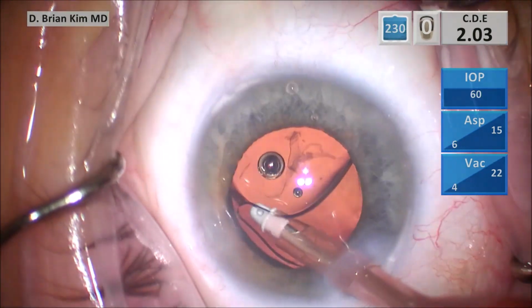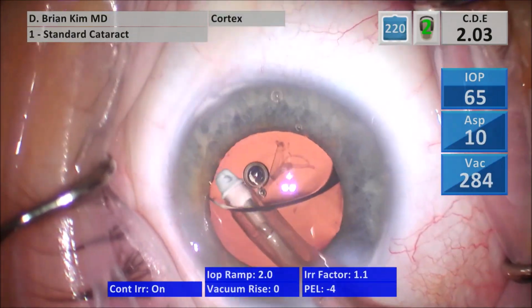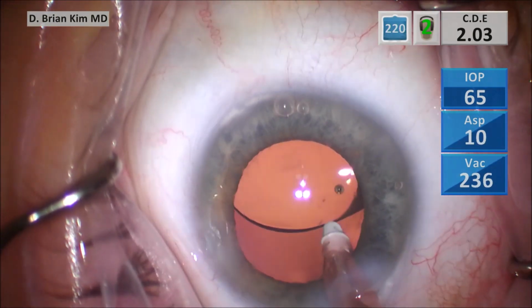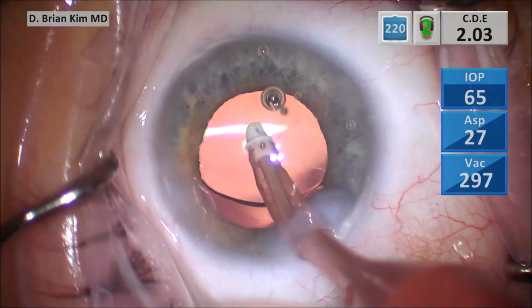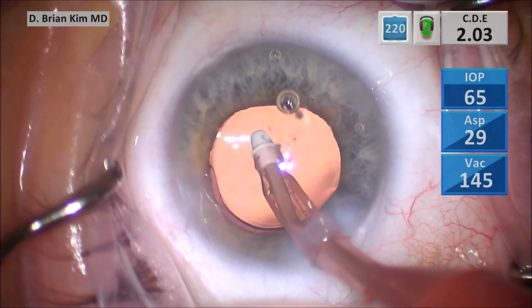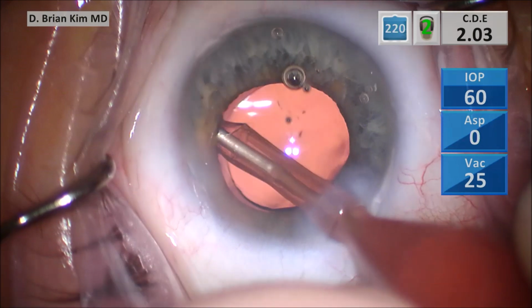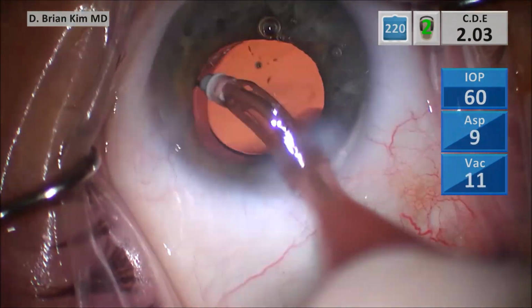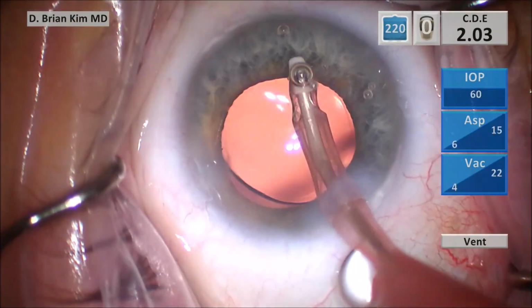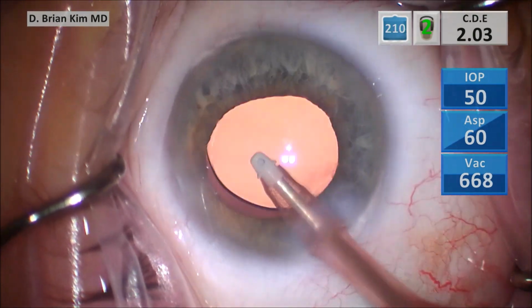And so when I'm going after lens pieces with vacuum, if I have to, I can use a chopper to retract the pupillary edge. It's almost like a dynamic iris hook. Using the chopper is like a dynamic iris hook. I'm able to retract the iris edge very easily as I go when I'm going after lens pieces with the phaco tip. So again, those are my 4 pearls and tips in dealing with intraoperative floppy iris situations without having to use iris hooks and iris rings, and being able to be confident with your cataract surgery.